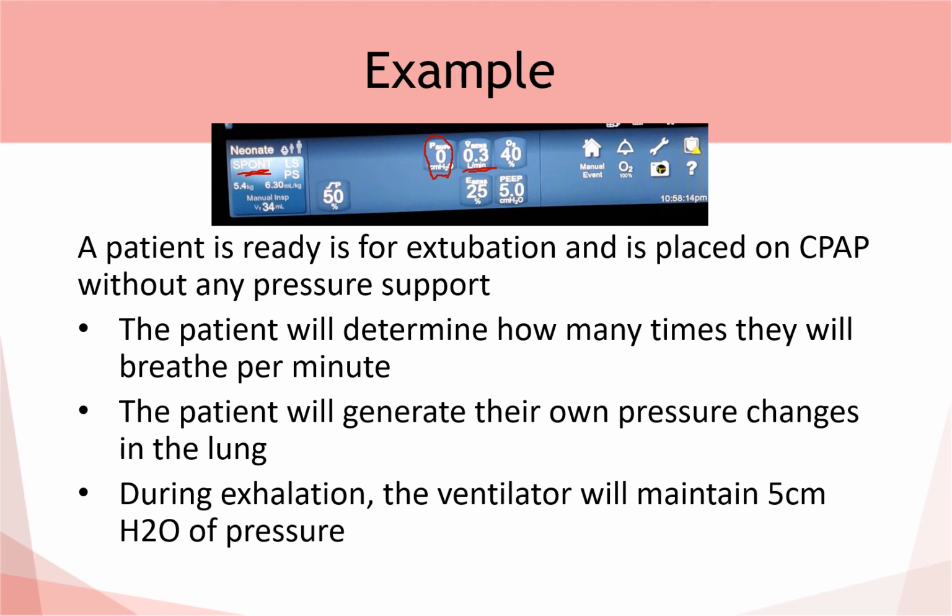What is selected is the end expiratory pressure, which is the PEEP. So at the end of the breath, when the patient exhales, there's 5 centimeters of water pressure that's left within the tubing. This patient will basically be breathing on their own. They'll dictate how many times per minute they breathe. They will generate their own pressures within the lung when they take a breath in, but when they breathe out, they will breathe out to a pressure of 5 centimeters of water pressure.